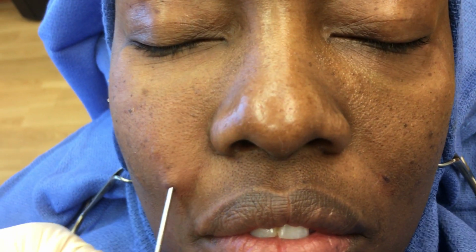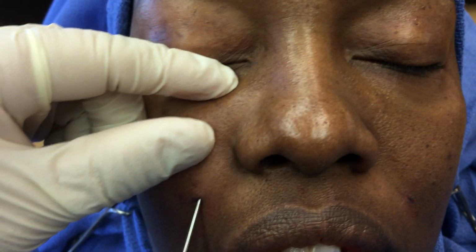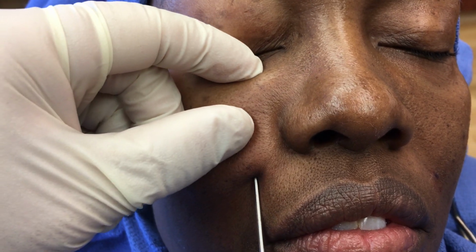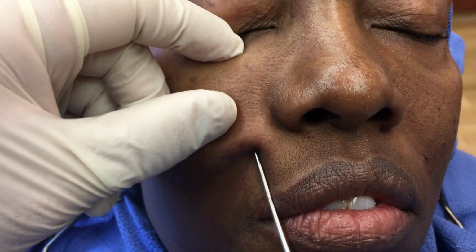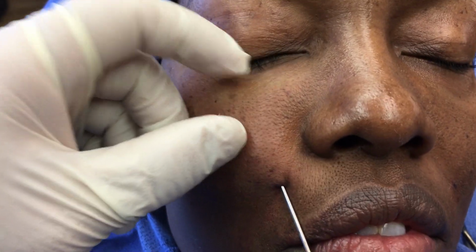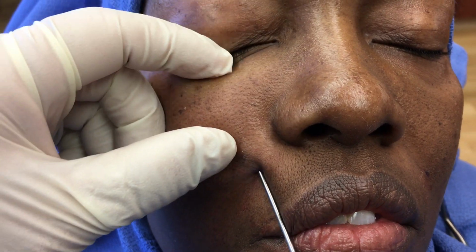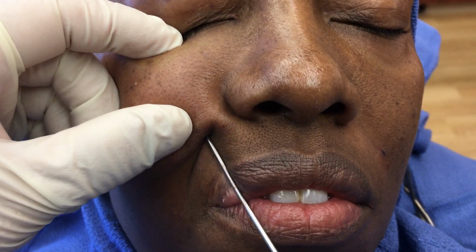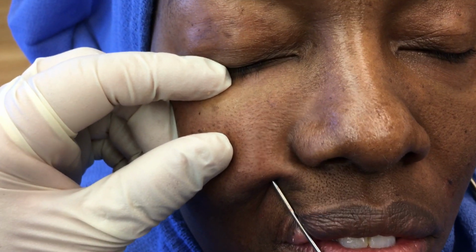So right now, this is our 3rd syringe. For those of you that have done Juvederm before, you know that oftentimes you'll buy just 1 syringe or maybe 2 syringes, and you think that's too much. Right now, this is our 3rd syringe of 3 cc's each. So we're actually putting close to 9 cc's into her, equivalent of 9 Juvederms into this cheek area. So that's how you kind of know that that 1 cc that you're buying usually is not too much.